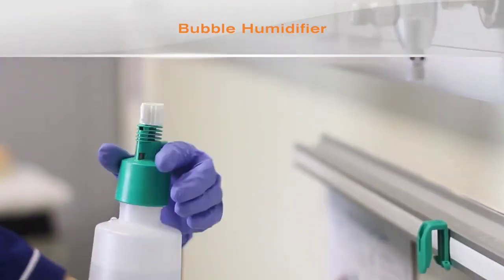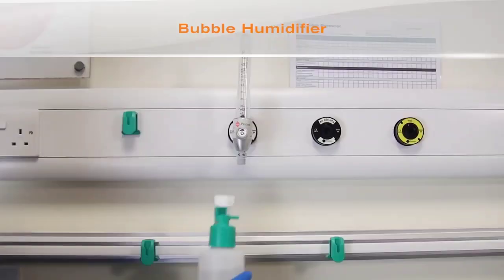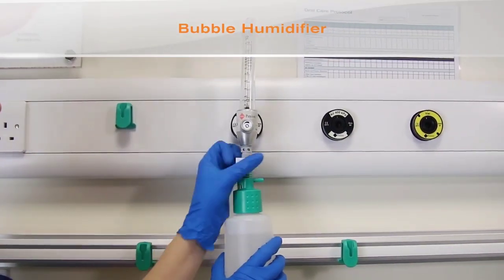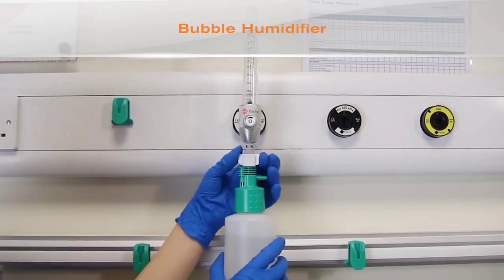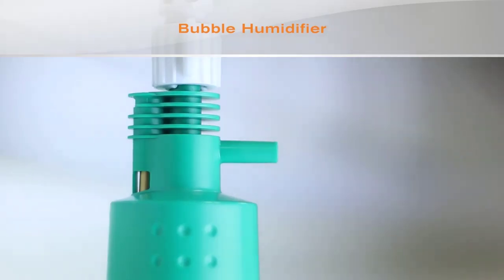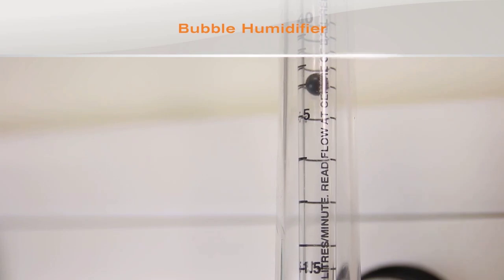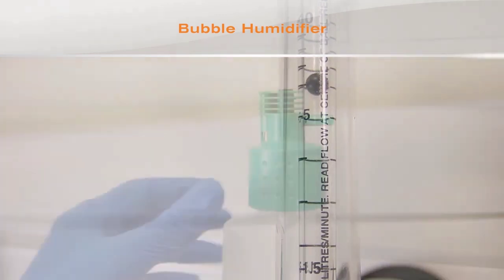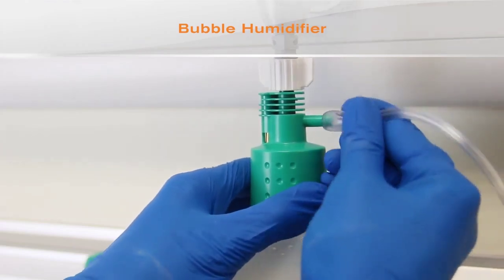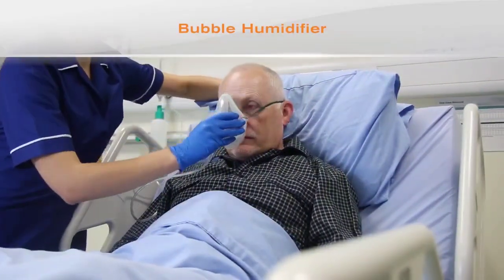The flow meter should be attached to an appropriate oxygen supply. Fill the bottle with sterile water using an aseptic technique and fit to the humidifier head. The humidifier should then be attached to the flow meter. To test the pressure relief valve, adjust the flow meter to 4 litres per minute and occlude the outlet. Verify that the relief valve operates within 5 seconds. Reset the oxygen flow meter to the appropriate flow for the patient. Attach the oxygen tubing to the bubble humidifier and the delivery device and fit to the patient.